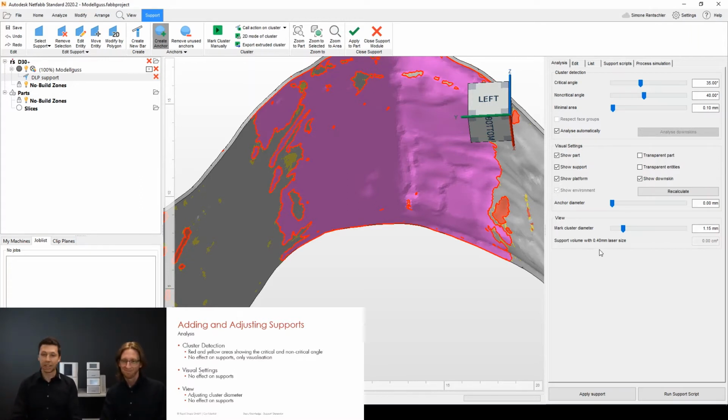Yeah, so the last one is just the view settings, and I can set in here the cluster diameter for manually adjusting or manually adding a cluster, which I will show you later how to do it. In here you can change the diameter of it. Later on we will see directly what this is going to do with it. Okay, for now no questions. A little bit of information is already at your side, so we will continue with giving some more hints for you.